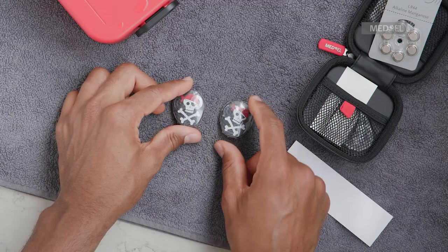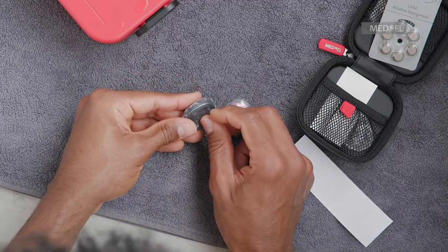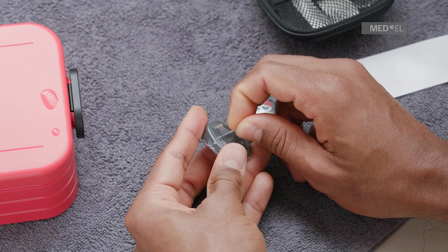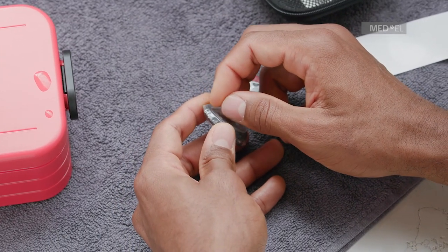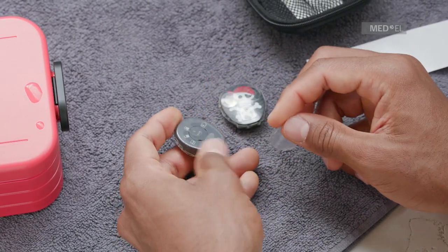To remove Waterwear from Samba 2, carefully remove and discard the adhesive seal tape from Waterwear. The skin of Waterwear can be used up to three times, but the adhesive seal tape needs to be replaced every time.